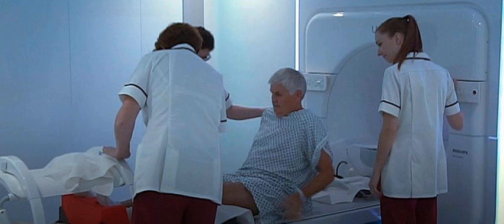The first patient in the UK has been treated in an innovative new radiation therapy machine. The MR linear accelerator scans tumors in real time while supplying X-ray beams. It means clinicians can schedule and adjust radiation therapy in real time, enabling it to be more precise. They expect it will lead to more patients being cured while experiencing fewer side effects.